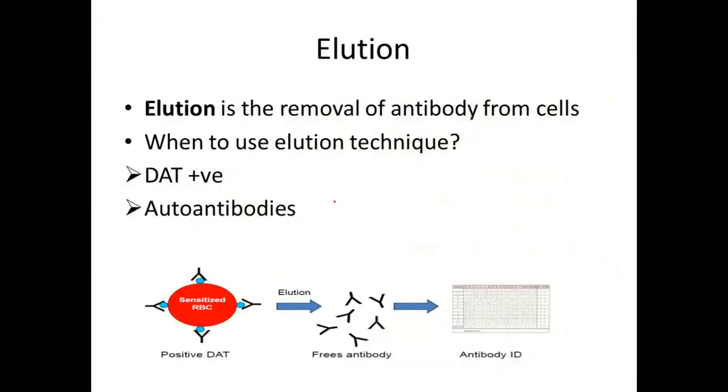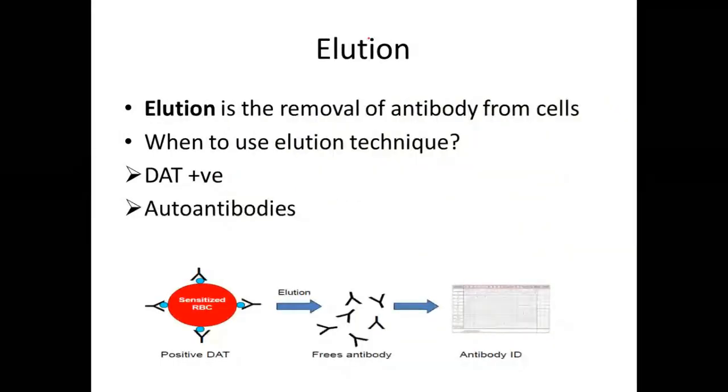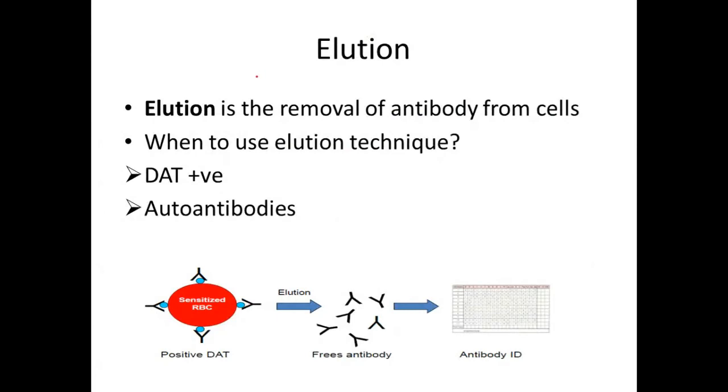Excellent. Now we understand the rosette test and the Kleihauer-Betke test. We said we do it when the result is positive, because it is now confirmatory and a quantitative test, so it will give me the exact amount. Let's move now to elution.